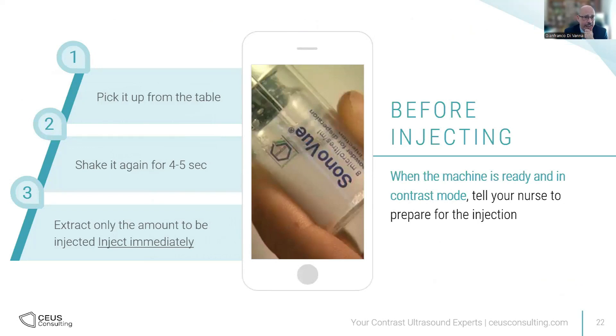When the machine is ready and in contrast mode and you're waiting for the nurse to extract the injection, avoid extracting the contrast before you are ready to scan. Avoid keeping the contrast in the syringe because there's no way to recombine the gas inside and you will have less concentration. Instead, make sure you're already ready for the contrast injection, then ask the nurse to extract. Pick up from the table, shake again for five seconds, extract only the amount you will be injecting, and inject immediately. Try to do this process as quickly as possible every time — picking up, shaking, extracting, and injecting. That will guarantee maximum enhancement.